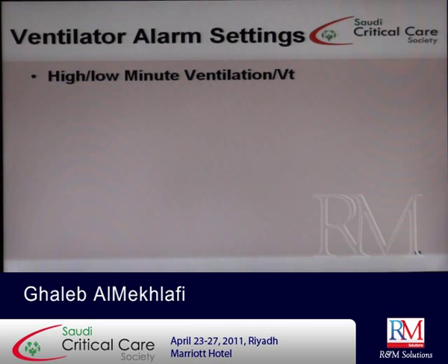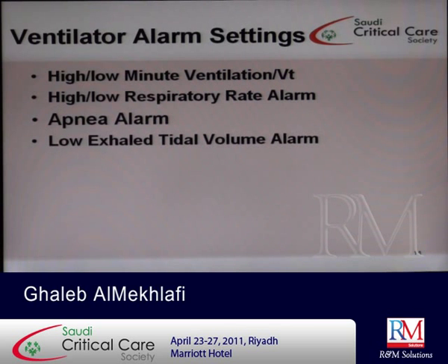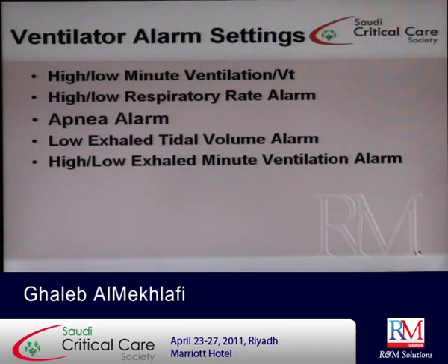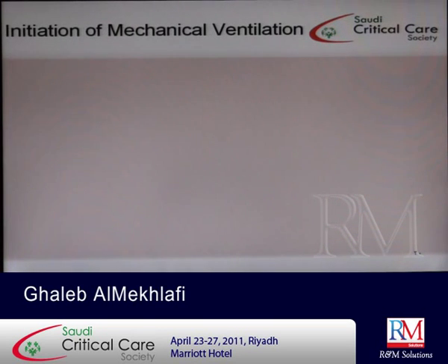So we have a lot of parameters that should be adjusted for the alarm setting. You can have high-low minute ventilation, high-low respiratory rate alarm, apnea alarm, low exhaled tidal volume. Actually, it depends on the ventilators you are dealing with, and the parameters can be different from one ventilator to another. Alright.